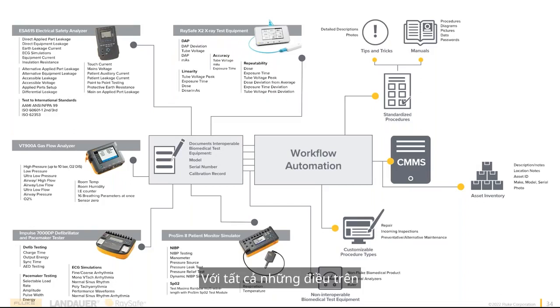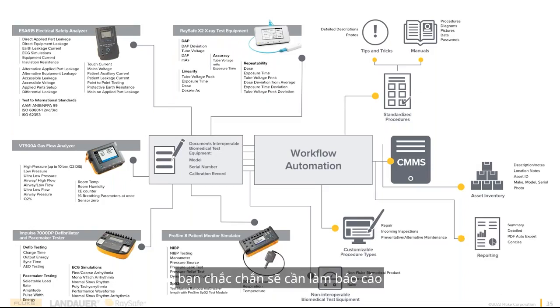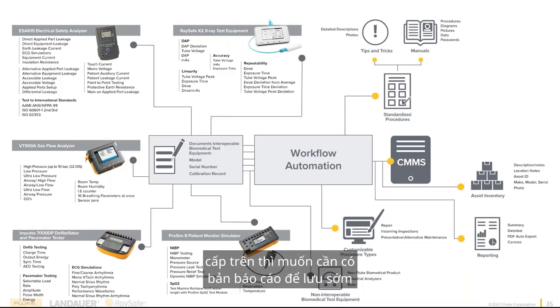So all these things, when we're done with the procedure, then we need to generate some reports. This can be a function of the CMMS system, or this can be a standalone. The nice thing about this is, say you get a call in, there's a new piece of equipment coming into the OR, you go and test it real quick, and they want to print it out for their records.